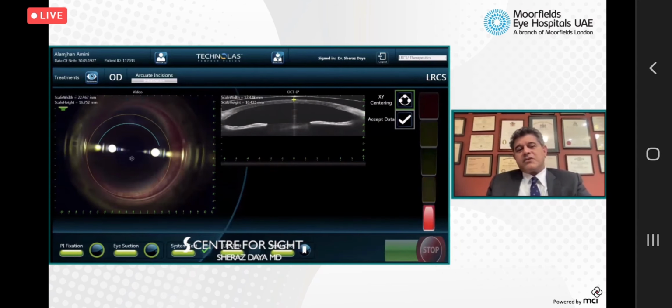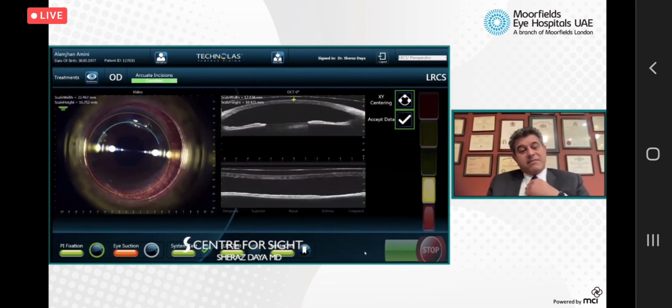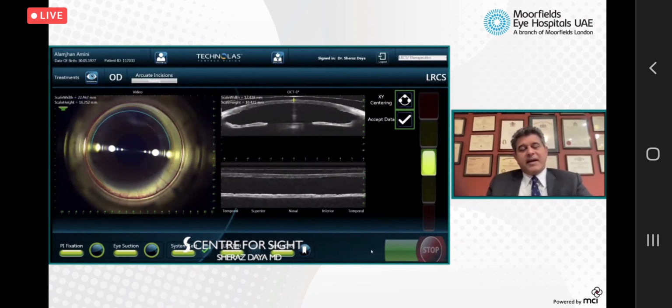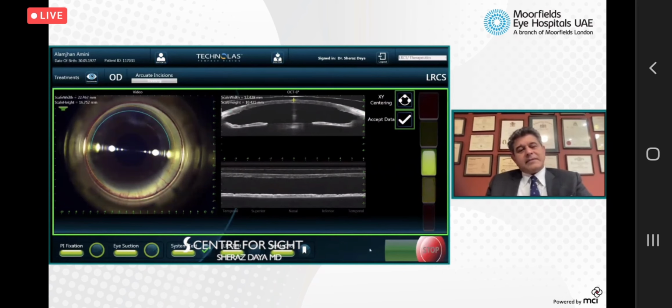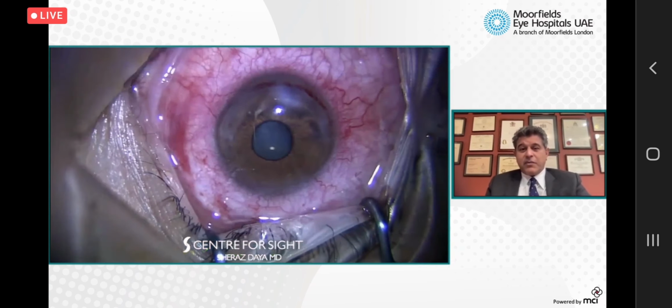So the important thing is to do the central cut first. With a peripheral cut, you can always use a knife if necessary, but it's the one closest to the visual axis that you want to be as symmetric as possible. And this is what I've done here. So once that's been accomplished, and it's a 180-degree cut, let me go ahead and do the periphery. And again, here's hoping for the best. At worst, if it didn't cut through to the depth that we wanted, then we would at least have it scored, so I know with an outline and maybe some cuts where we're going.